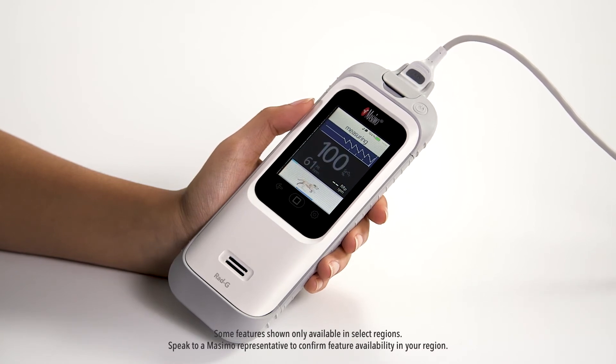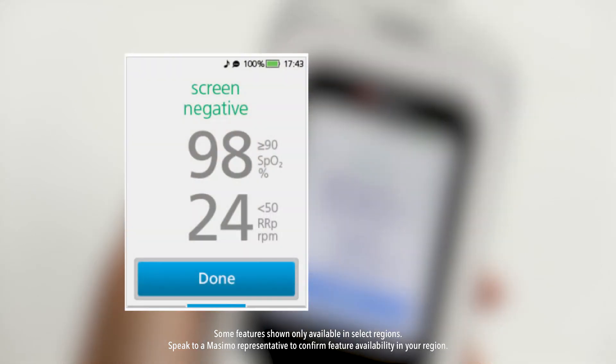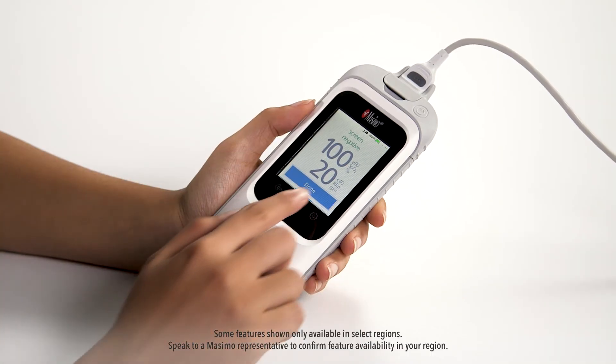If necessary, hold the child's hand or foot still during the screening. Once complete, the screening result will display either screen negative in green or screen positive in red. If the screening indicates screen positive, refer to local protocol to determine whether to treat, refer, or release. Touch done to complete the screening.